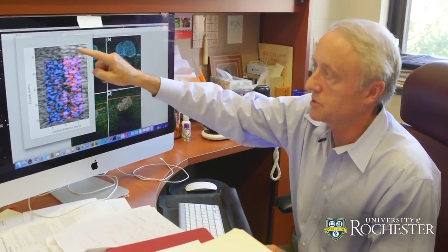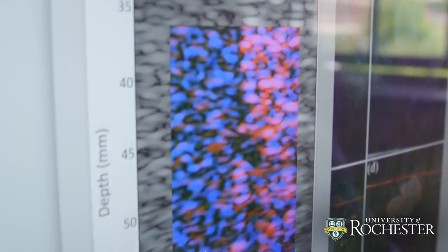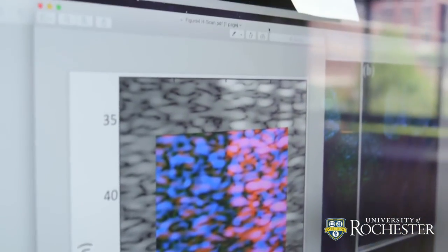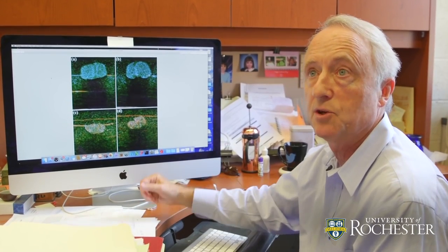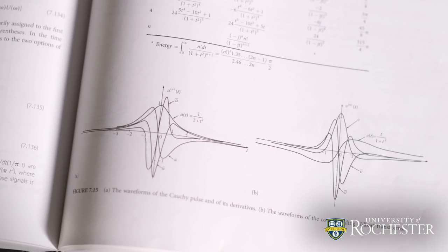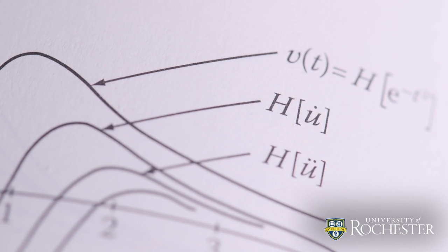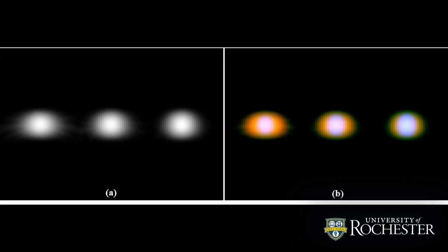On the outside of the screen is the old fashioned black and white B scan. What we've done here is a very special analysis based on what comes back from larger and smaller objects. They have a certain signature and we're looking for that signature mathematically, then we display it as colors. The color tells you something about what the scatterers are inside the tissue, inside the cells.